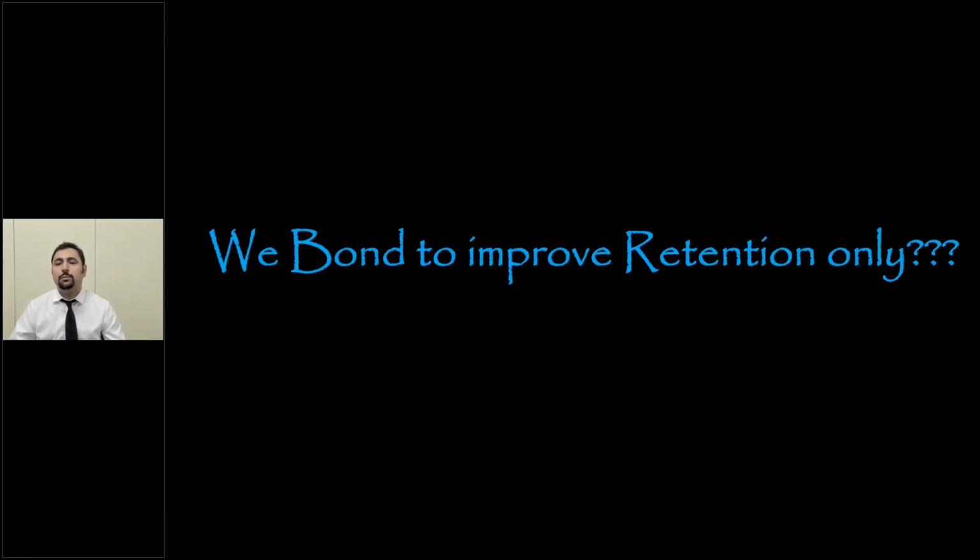All right, last tip. Why do we really bond to a zirconia crown? Is it just because of retention? So we know that when we have a prep that is less than 3 millimeters in height, or more than, I don't know, 6 degrees in taper, so we don't have enough retention based on the tooth, if it's a molar, premolar, whatever, that way, we would be recommended always to bond it to make sure the crown doesn't fall off.